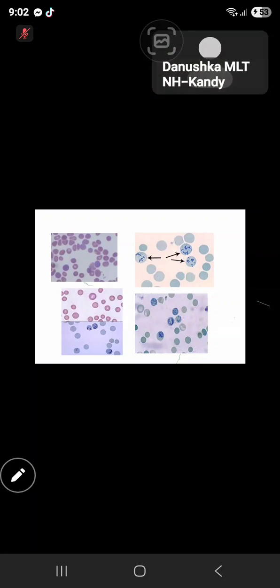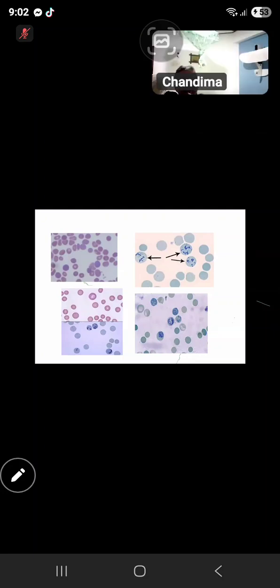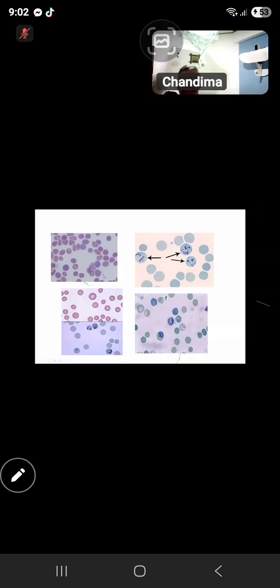In the case of supravital stain, what would the nucleated RBC look like? They are stained like white cells. Even the white cells can be stained with this supravital stain. The nucleus of an NRBC is stained a deep purple or deep blue color. It is clearly the nucleus that is stained. A reticulocyte is stained as a filamentous or dot-like fragment.